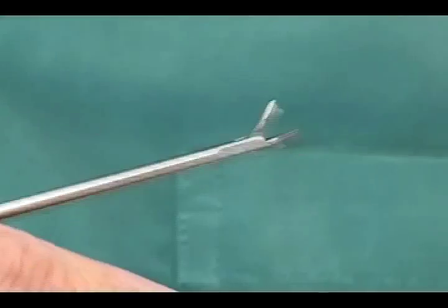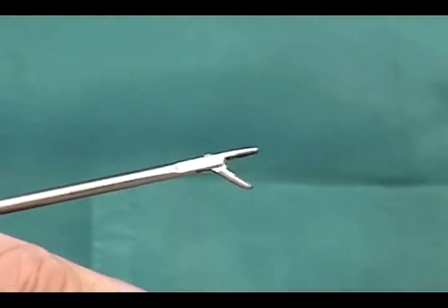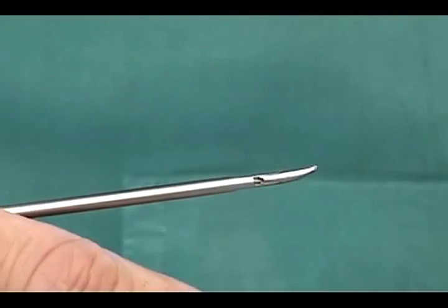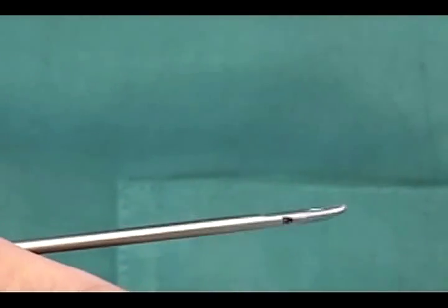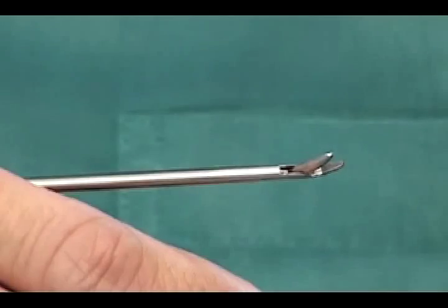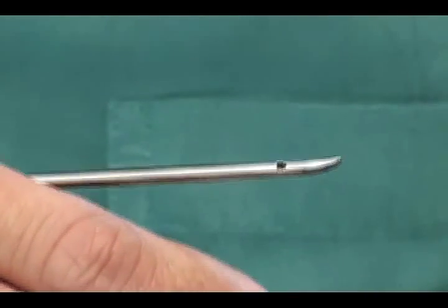The 3mm Ultra Micro Needle Holder from Carl Stoss is a very elegant piece of instrument. It has a slightly curved blade on a straight handle with ratchet, giving the surgeon a very comfortable hand grip and allowing easy rotation. The slightly curved blade also enables the surgeon to see the target more clearly, enabling accurate placement of sutures up to 7-0 or 8-0.